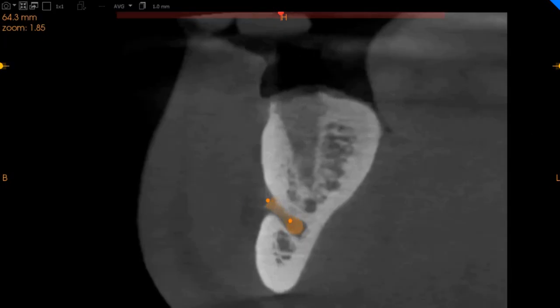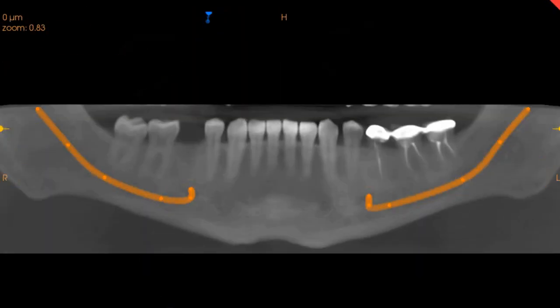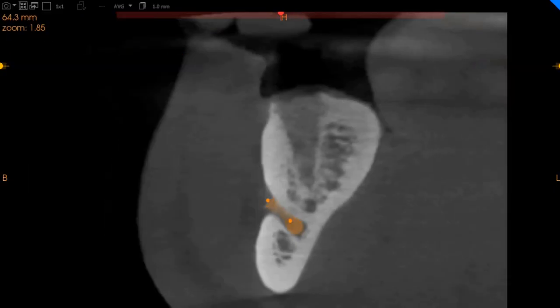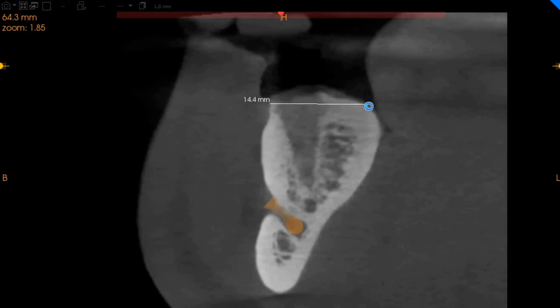Assalamu alaikum, Dr. Ala Qasqai. This is Qasqai Diagnostics. This is the CBCT of the patient that you had requested. The area of interest is the lower right quadrant for implant placement. You've got an edentulous area where a recent extraction has been done.